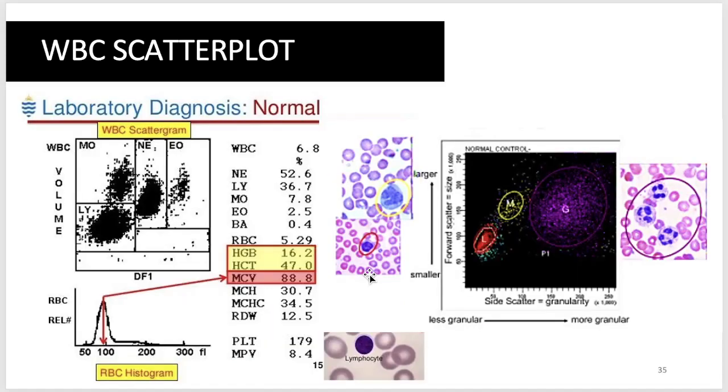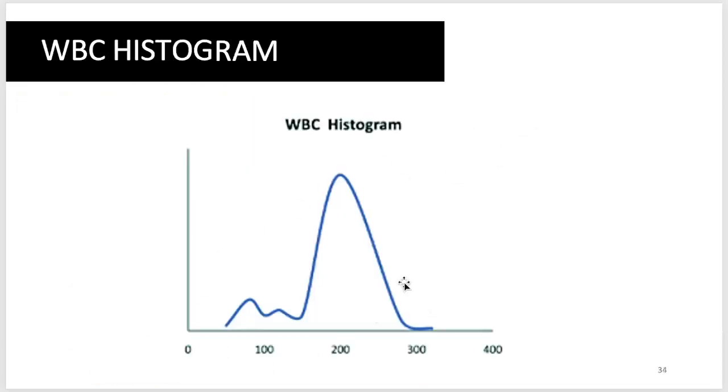Now, let's talk about your WBC scatter plot. Usually, makikita nyo to sa mga laboratory result, if you are using Abbott, Sysmex. Ganito ang nakikita natin, may mga diagrams. So, tingnan nyo yung mga WBC results nyo, yung mga high-end na machines, merong mga ganitong diagrams, including your histogram. At least you already know how to interpret those histograms.